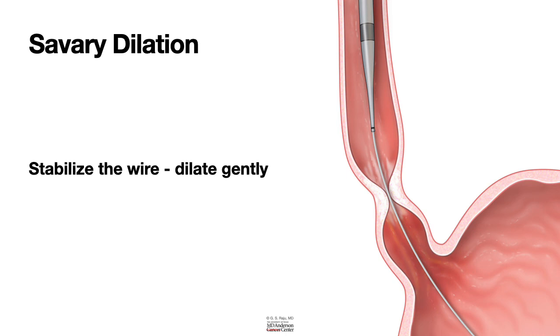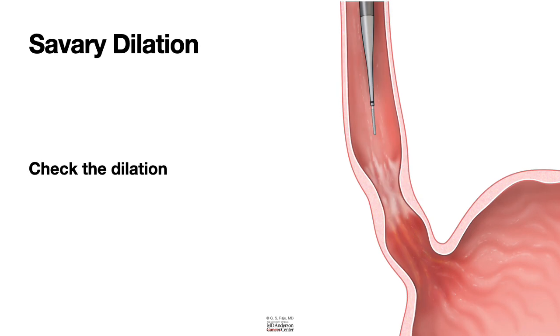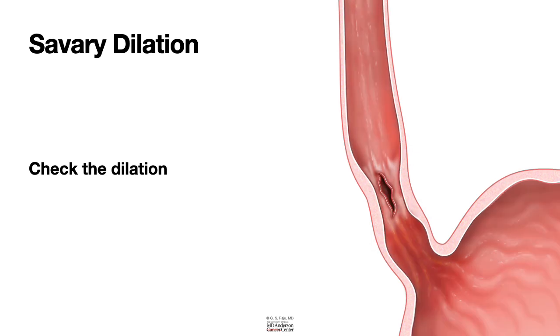Having said that, you have the wire securely placed, the dilator moves, dilates, and then at the end of the procedure, the wire and the dilator are pulled out together, and the endoscopist will decide and wants to check. You get your endoscope ready, and he wants to see if there's a tear, and if there is a tear, he will hold off further dilation. If there's no tear, he may say maybe we should dilate a little more, and the endoscopist will make that decision.